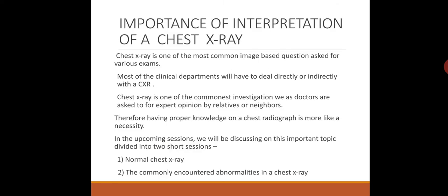So, chest X-ray is a very common investigation which we go through in our day-to-day life, and it is a very important investigation. Regarding the importance of interpretation of chest X-ray: chest X-ray is one of the most common image-based questions asked for various exams.